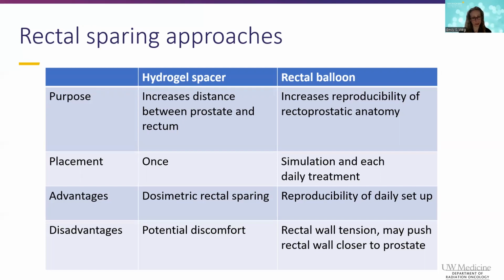The disadvantages of the hydrogel spacer: a handful of patients have a little discomfort. The procedure can be uncomfortable when we place it, and then some patients feel a little bit of residual fullness. And like anytime we put needles into the body, there's always a potential risk for infection, although that risk is very, very small.